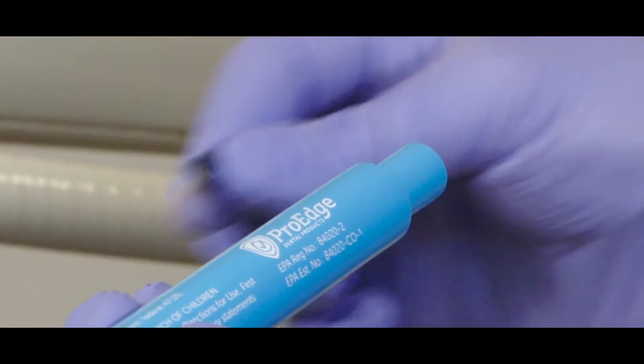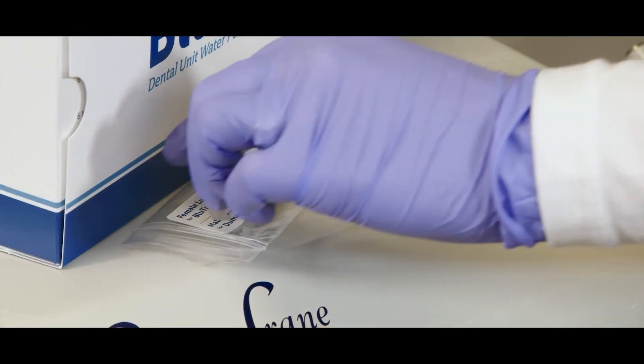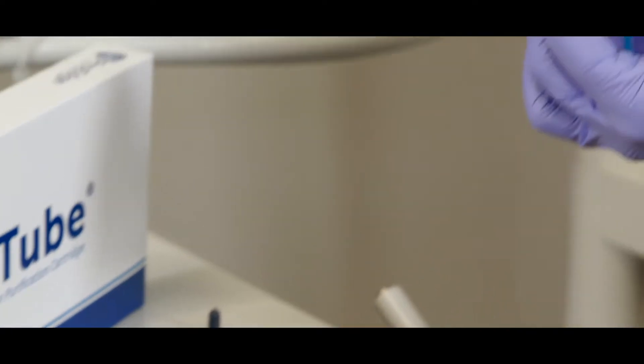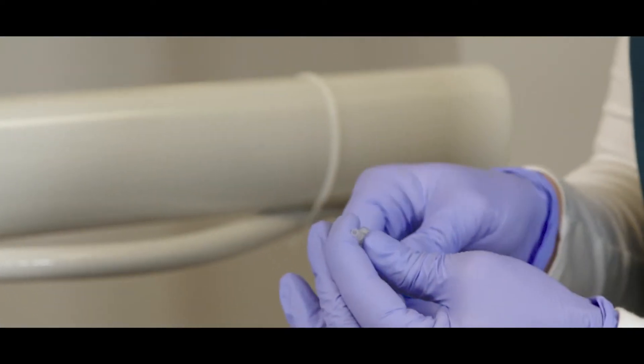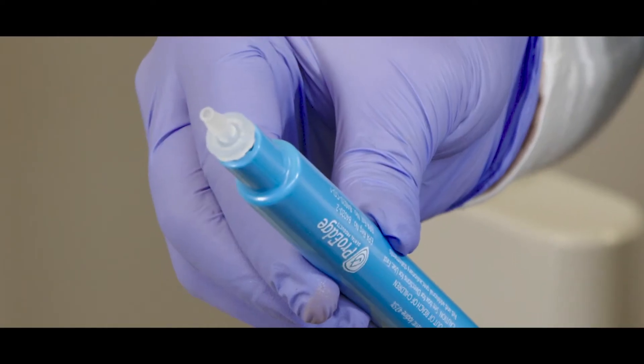Hey everyone, let's get your brand new blue tube installed. First thing you want to do to prep for installation: remove the vinyl shipping caps from both ends of the blue tube, and twist the female luer lock into the male end of the blue tube cartridge. Check the luer lock bag label to help identify the female luer lock.